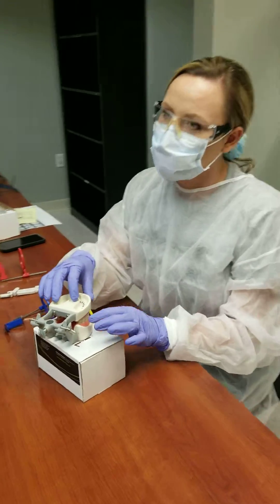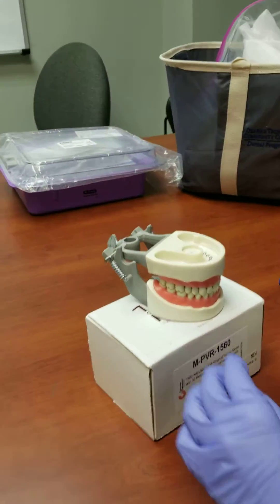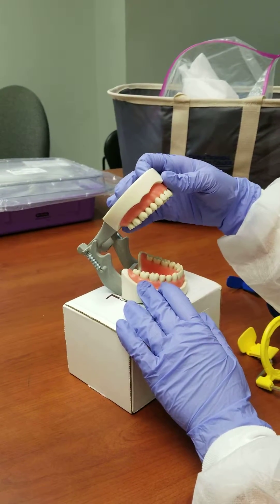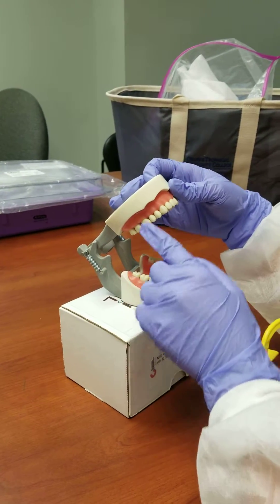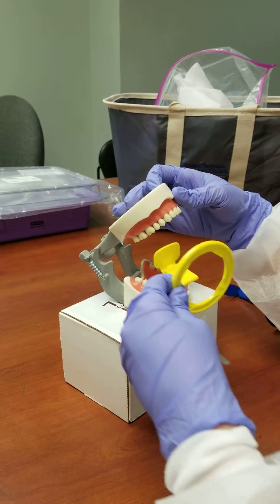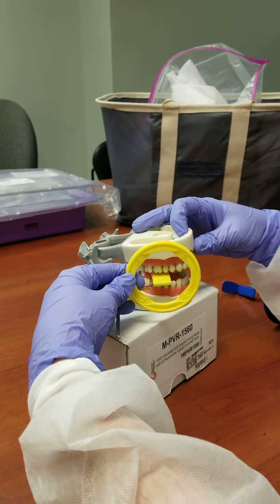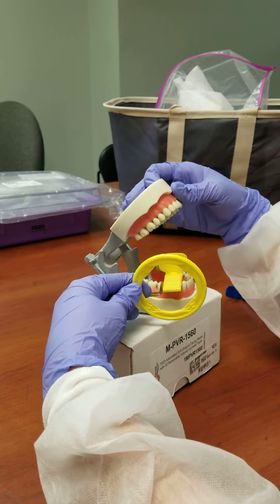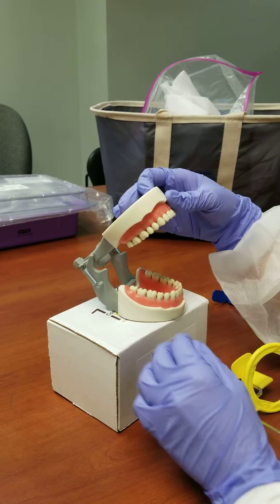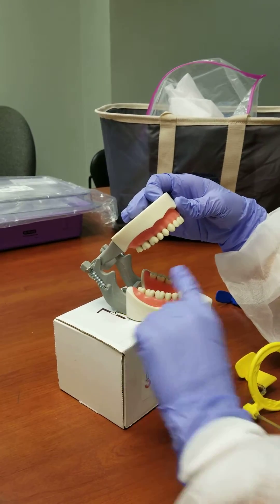My first image is going to be a PA of number 4, which is the right maxillary second premolar. Then I'm going to do a PA of number 31, which is the right mandibular second molar, right here.